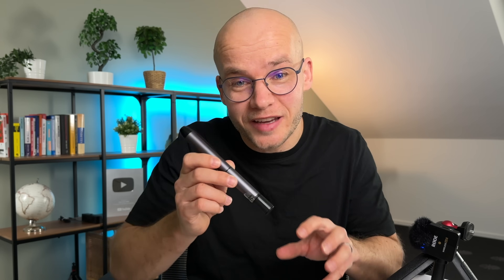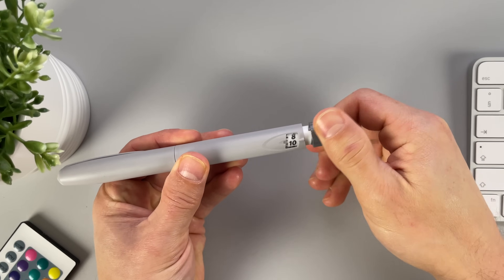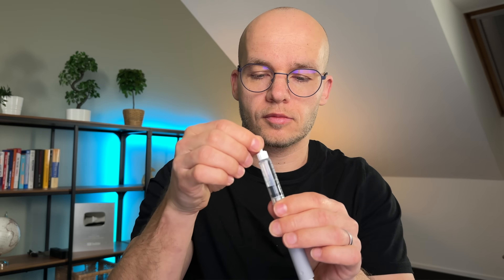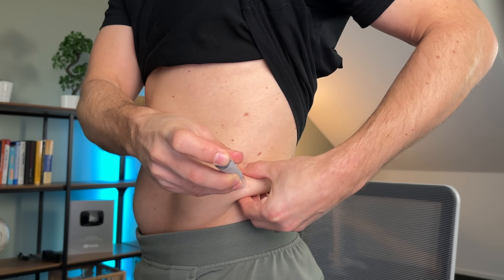There's one more InPen feature that's kind of hidden — you cannot see it, but it can save me a lot of trouble. The smart pen keeps an eye on the temperature of the insulin, and if it gets too hot or too cold, it will send me a notification. I've never had this warning come up myself, but I think it's a super important feature, because there's nothing worse than insulin going bad and not working properly when I need it. Also, InPen is intended for rapid-acting insulin only, so I need another pen for my long-lasting insulin — but the InPen app does remind me to take it at a predefined time.